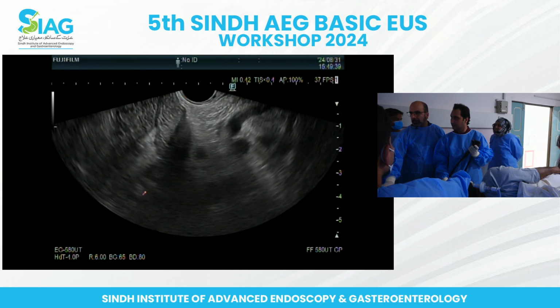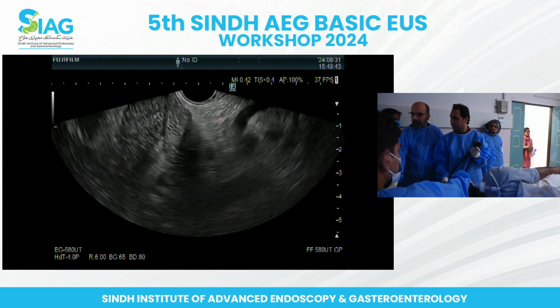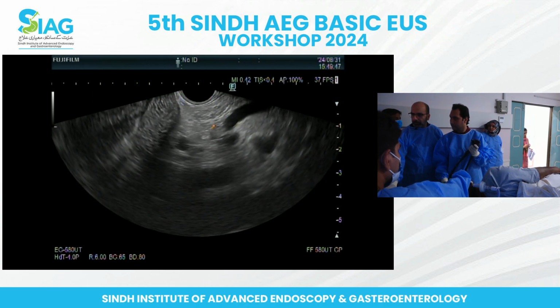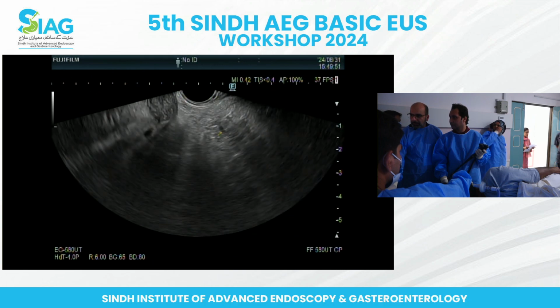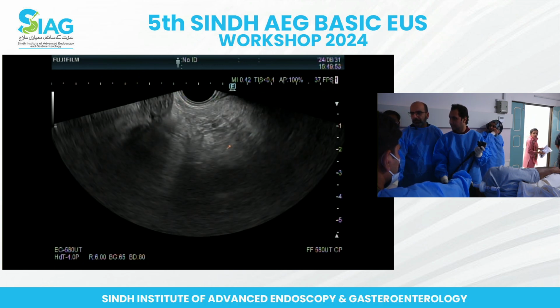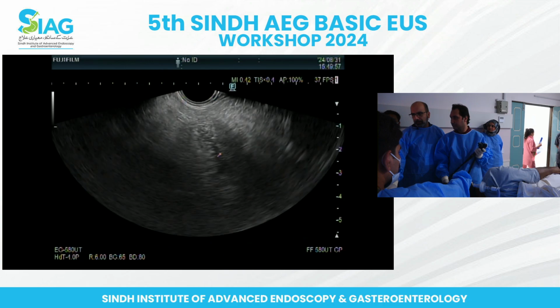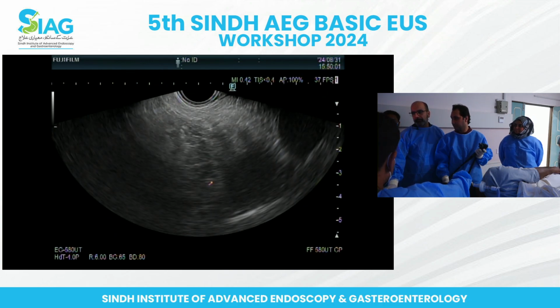And now it's going slightly. So you may have to do slight big wheel towards you to bring it closer to the probe, and keep going counterclockwise. There you go. Keep going, and that's the pancreas. Now the duct is dipping down this way, so pull back a tiny bit and go. There you go. Now that's the PD going towards the neck head area.